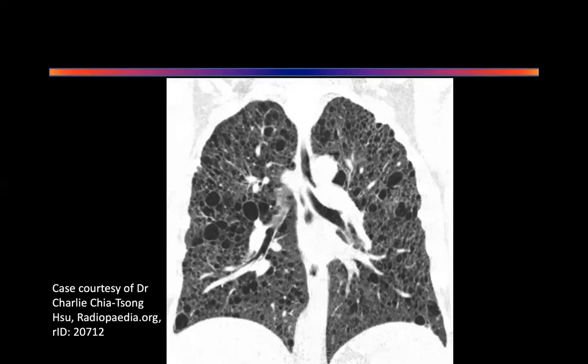This is a CT scan of the thorax showing both the lungs. It is in coronal plane and it is showing that there are multiple cysts in both the right and the left lung. The vascular structures are delineated, so it is a contrast enhanced CT scan. Yeah, good. What window? Sir, this is a lung window, sir. Good. It's easy. It's lung window.